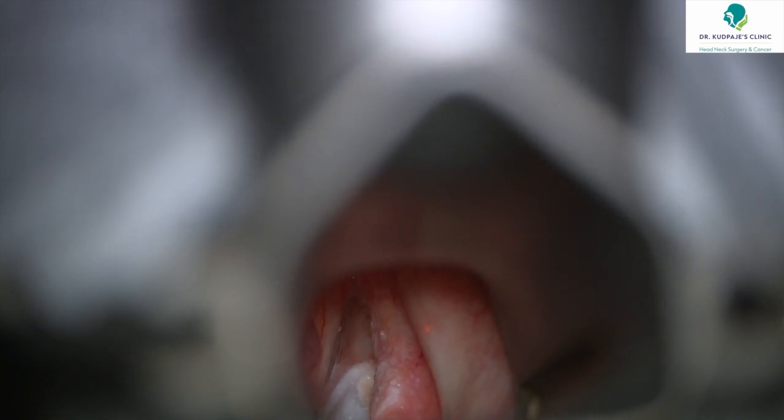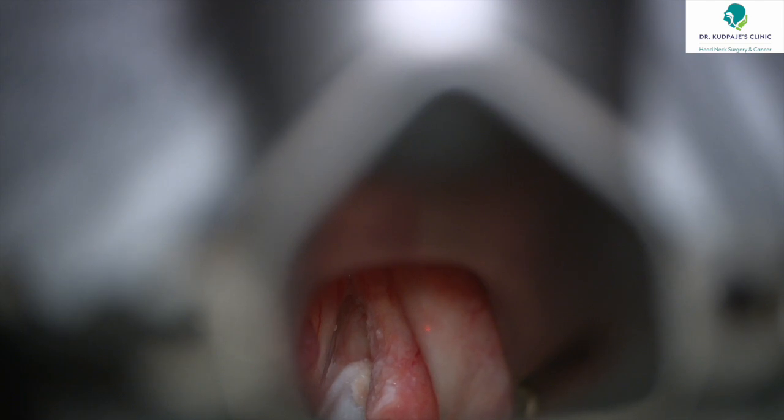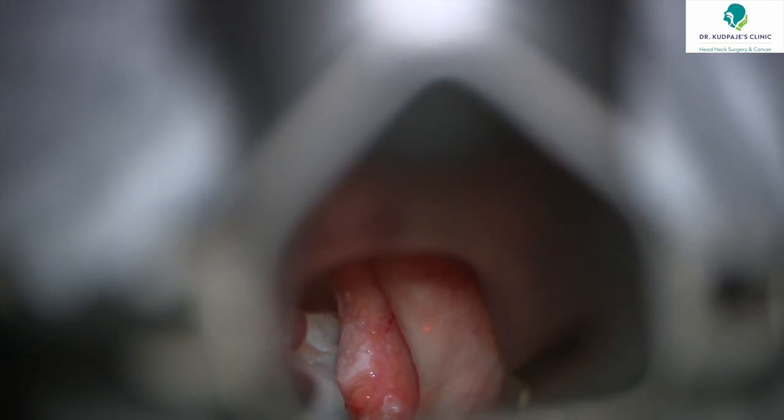On evaluation under anesthesia with the laryngoscope, it was a class 1 exposure and we were able to visualize the lesion in entirety. Since the lesion was a large lesion involving the entire vocal cord, the plan was to do a segmental resection in two parts. We started with the anterior third or anterior half resection, starting from the anterior commissure area, and the plan was to do a type 2 cordectomy.